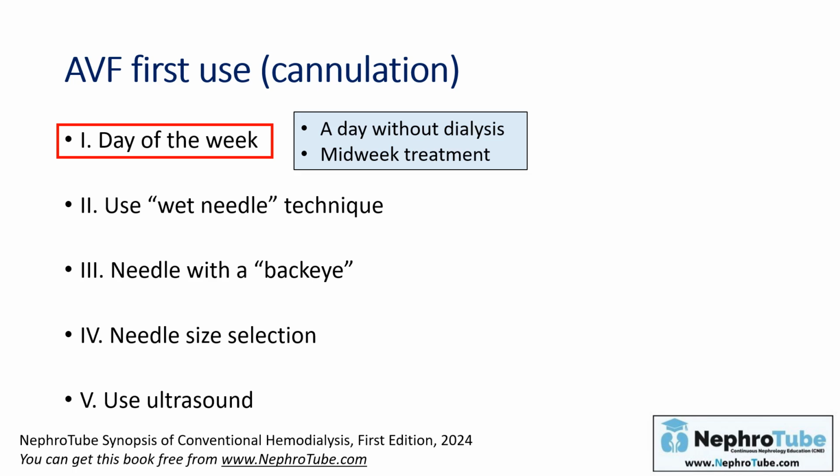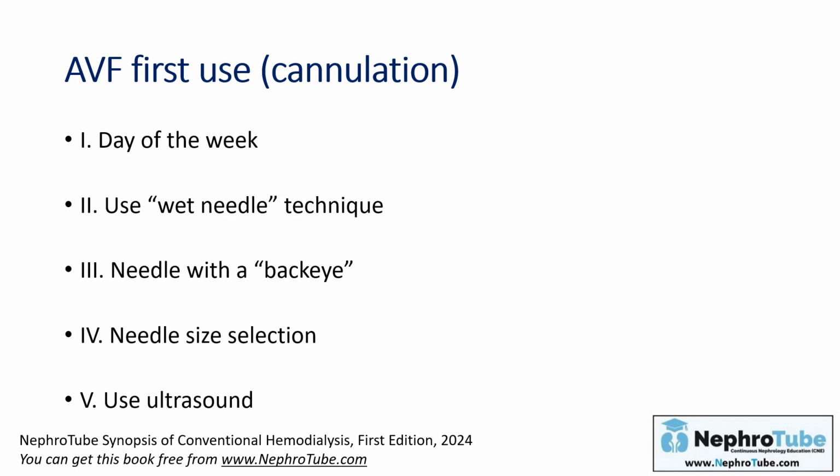Because on Saturday, the patient is coming from a long weekend interval, and there is a possibility of volume overload and high blood chemistries and abnormal bleeding and coagulation profile because of uremia. So it's better to avoid cannulation after a long weekend interval, and it is preferred to cannulate the patient for the first time in a midweek treatment.